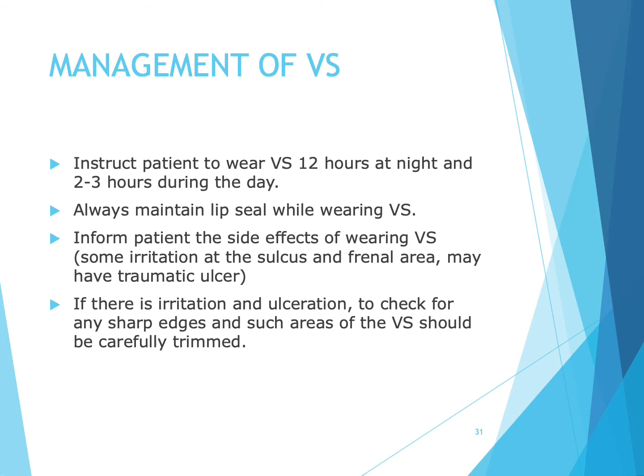There will be some irritation at the sulcus and frenal area, and there may be some traumatic ulcer. If there is irritation and ulceration, we need to check for any sharp edges, and such areas of the vestibular screen should be carefully trimmed.